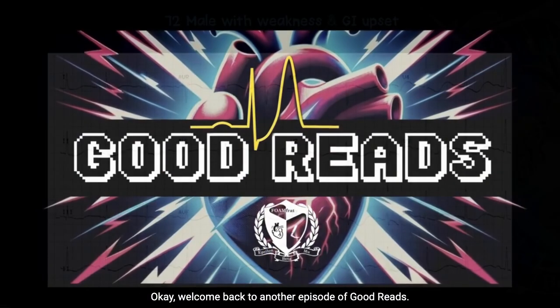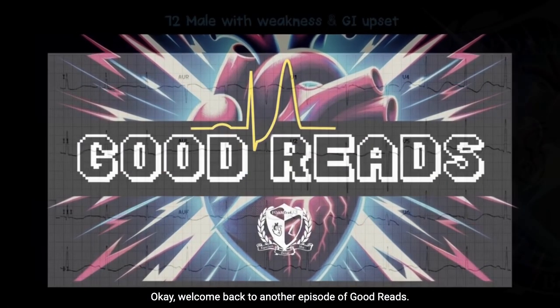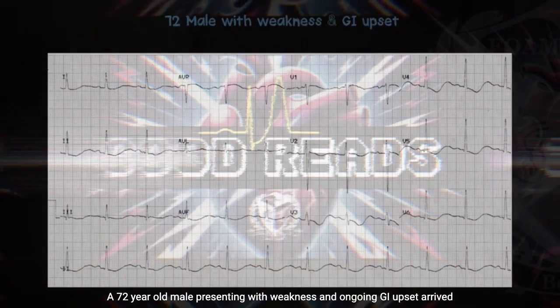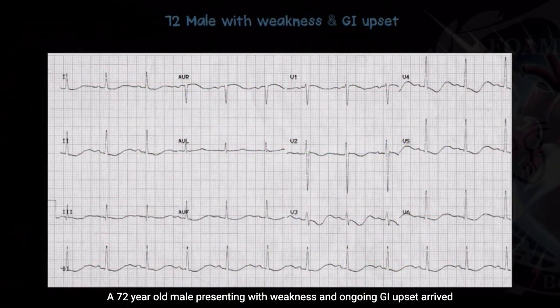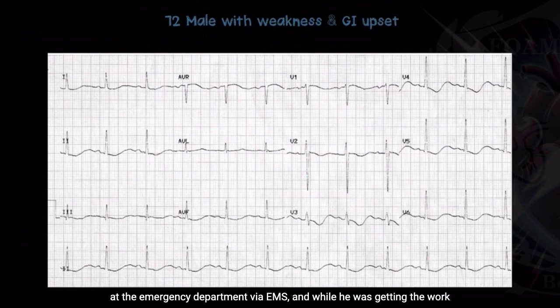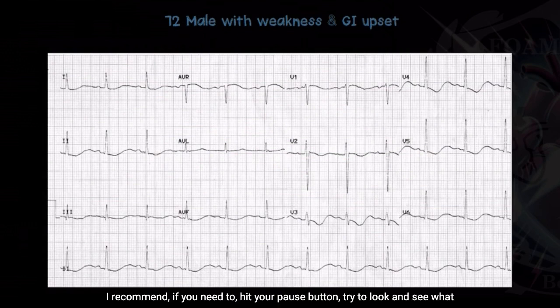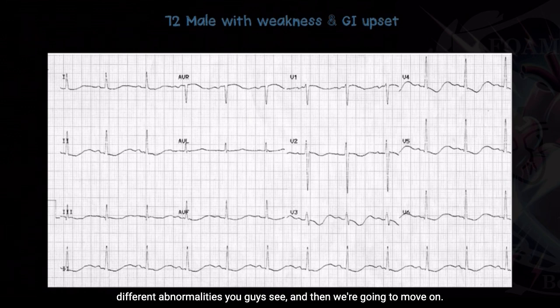Welcome back to another episode of Goodread. I'm going to jump right into a case. This 72-year-old male presenting with weakness and ongoing GI upset arrived at the emergency department via EMS, and while he was getting the workup there in the emergency department, this was the initial 12-lead EKG. I recommend, if you need to, hit your pause button and try to look and see what different abnormalities you see, and then we're going to move on.